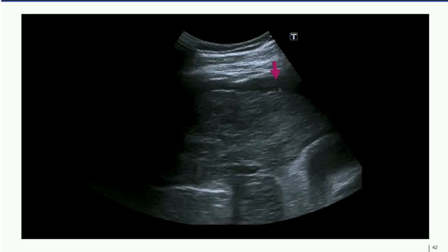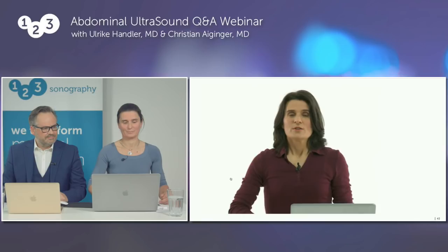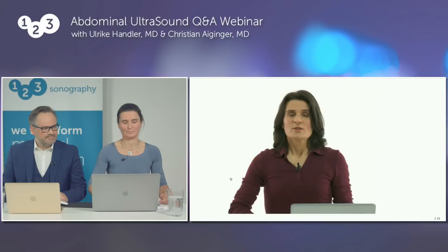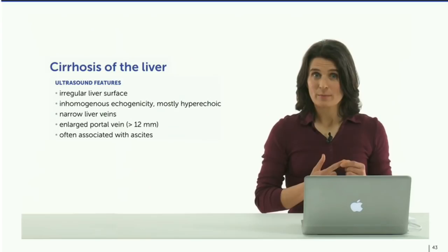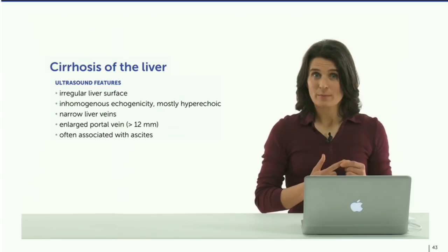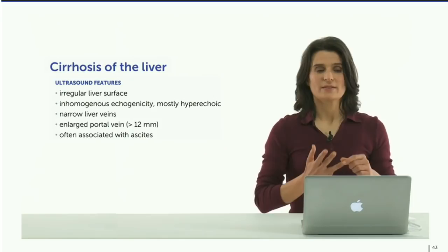Take a look at this small dark area — it's free fluid, pointing to ascites. This means the patient has already an advanced case of hepatic cirrhosis. Ultrasound features of liver cirrhosis: the humpy irregular liver surface compared to a normal smooth capsule, inhomogeneous echogenicity of the liver parenchyma, narrowed liver veins, and an enlarged portal vein due to portal hypertension. Advanced cirrhosis is associated with ascites.